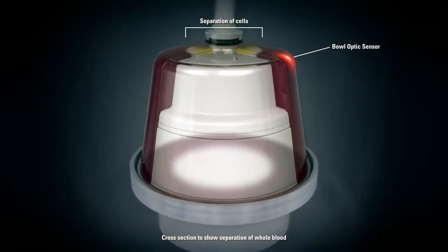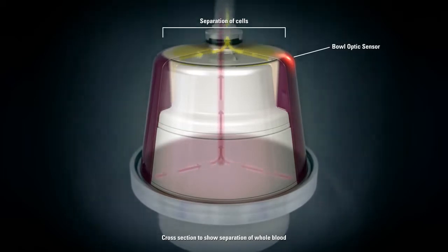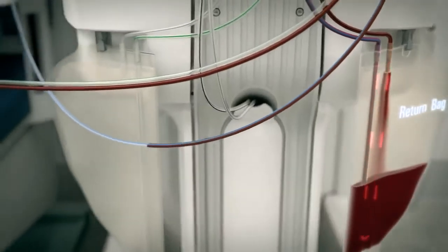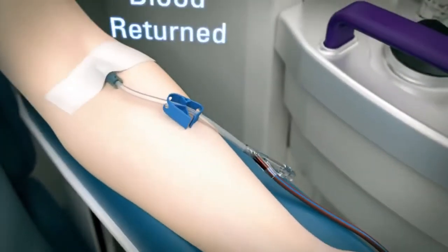As the centrifuge separates the plasma and RBCs from the buffy coat, the double needle technique allows for these separated components to be safely returned to the patient, reducing the extracorporeal blood volume and ensuring a continuous one-time buffy coat harvest.